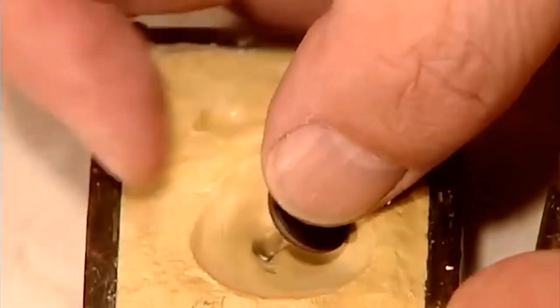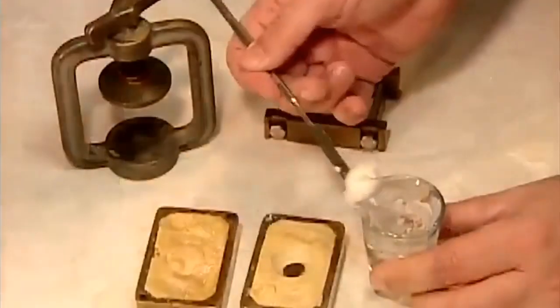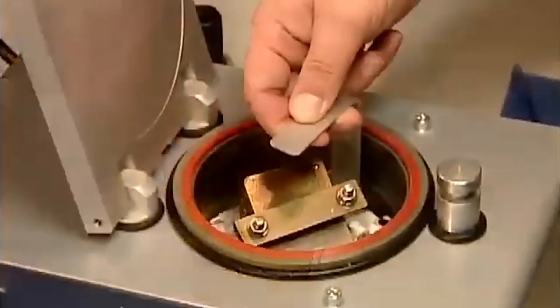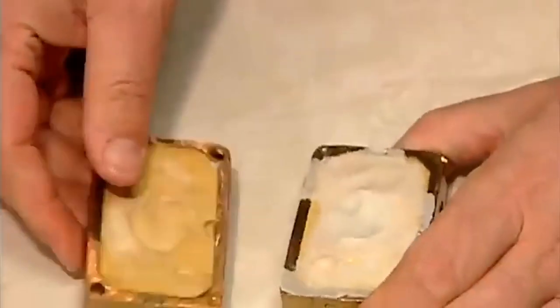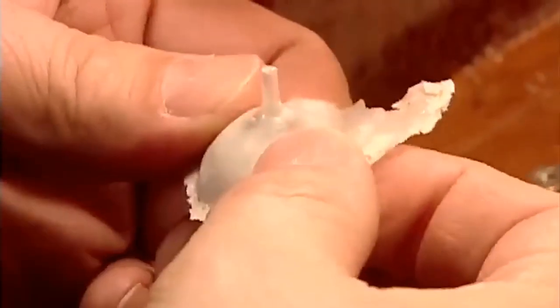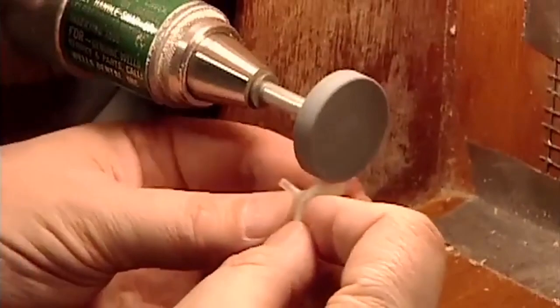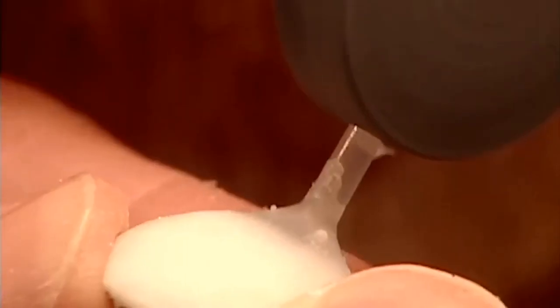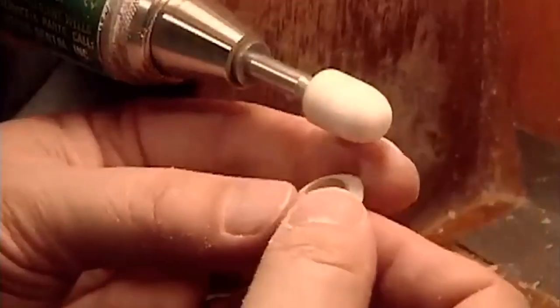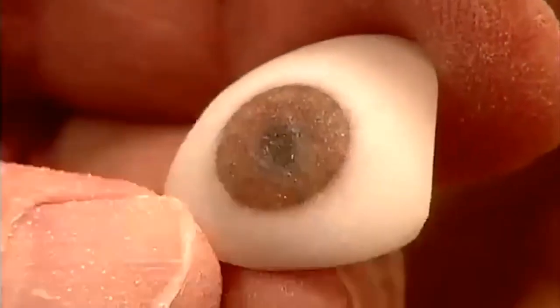The iris then goes into the plaster mold, covered with white acrylic dough. After the same high-pressure curing process as before, out comes the artificial eye, covered with excess white acrylic. They trim off that excess and the peg using a grinding tool and a cutter. This refines the shape and exposes the iris buried underneath. They smooth the surface against a grinding stone and verify the measurements.